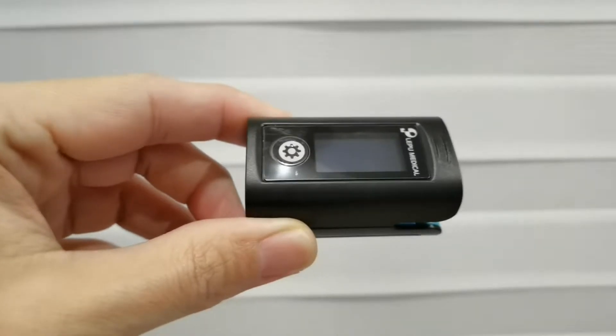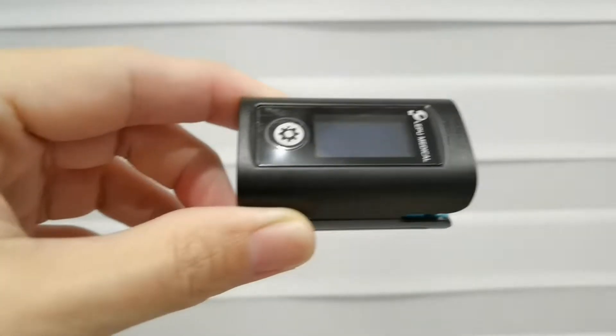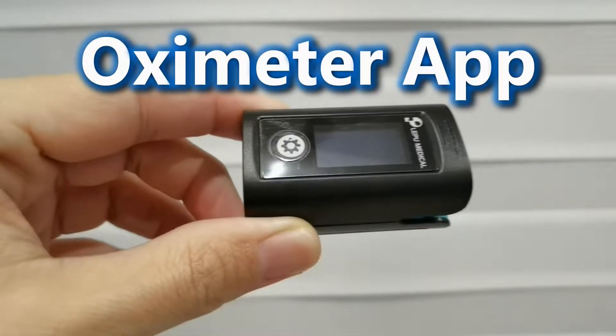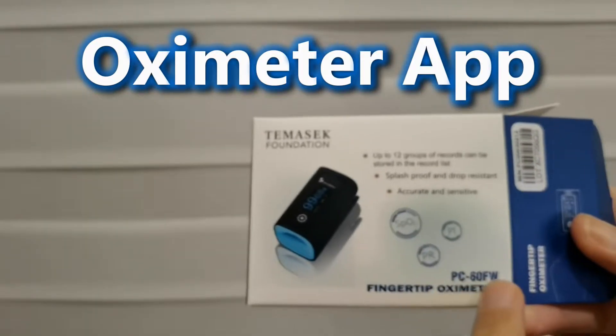Hey guys, this is Joe. I wanted to share something I found out: if you read the manual, you realize that there is an app for this device. Based on this model, there's an app for this oximeter.